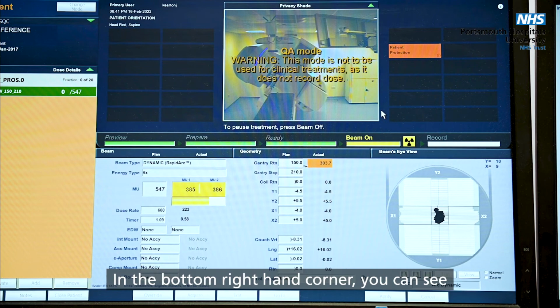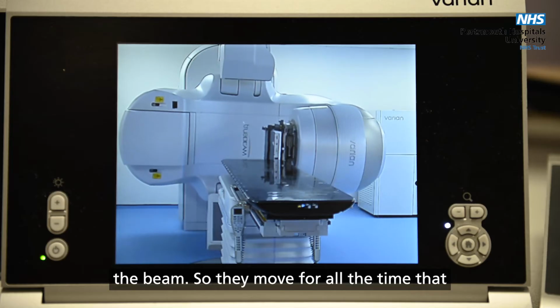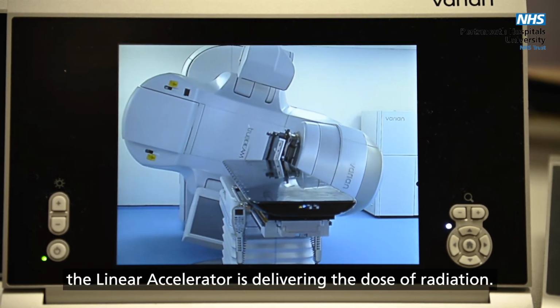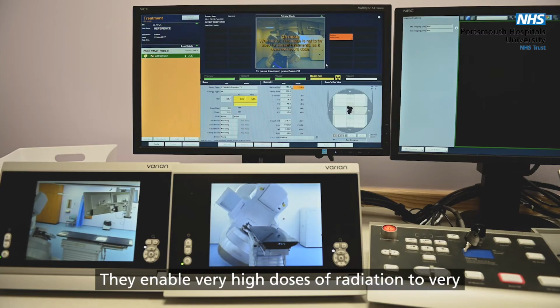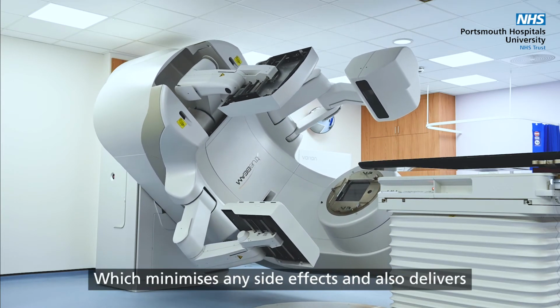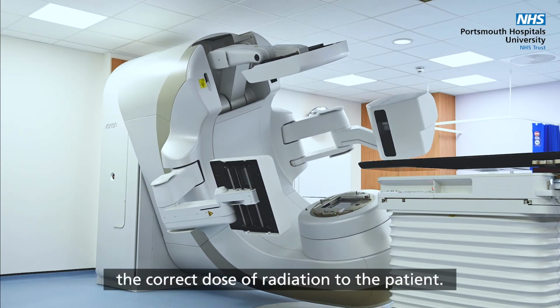In the bottom right hand corner you can see the multi-leaf collimators. They're used to modulate the beam, so they move all the time while the accelerator is delivering the dose of radiation, and they enable very high doses of radiation to very prescriptive areas of the patient, which minimises any side effects and also delivers the correct dose of radiation to the patient.